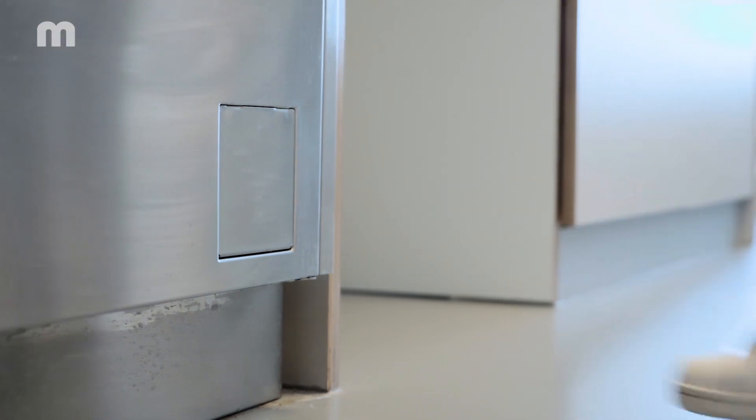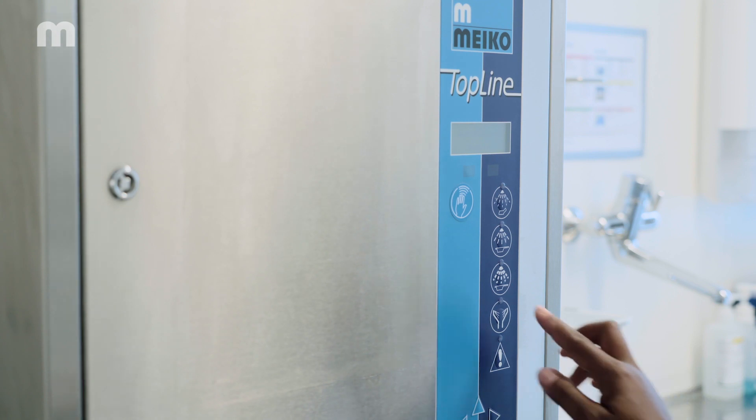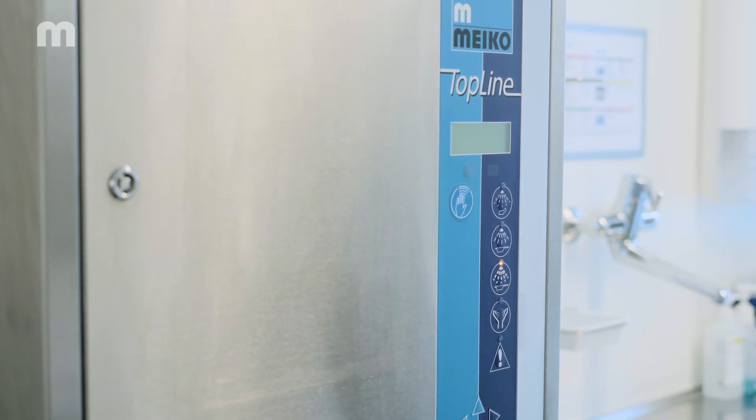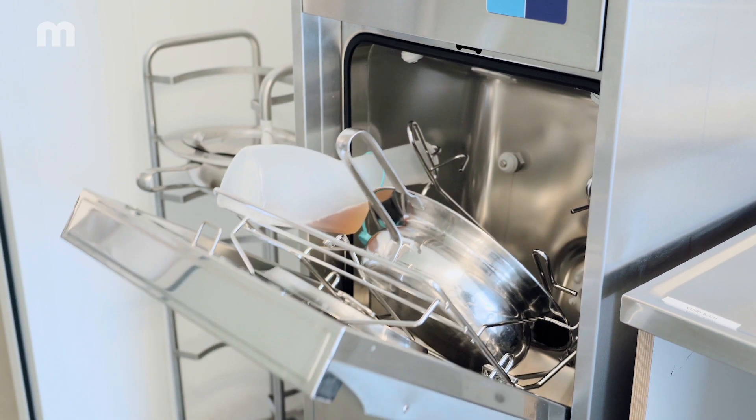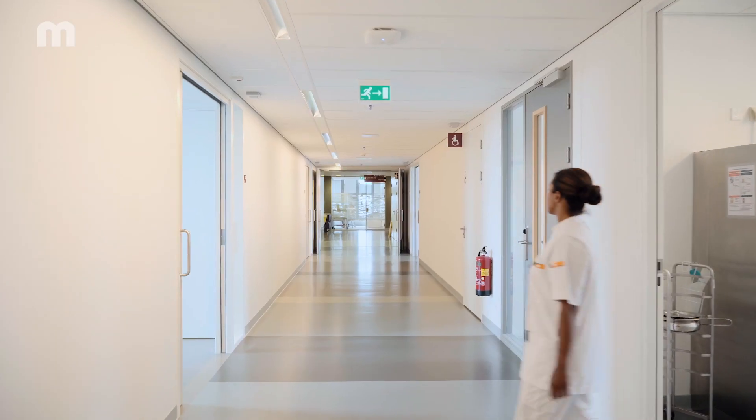Close the door using the foot switch or by holding your hand up to the sensor. Using your clean hand, now select the required program. Once the door is closed, the contents are emptied hygienically inside the appliance.